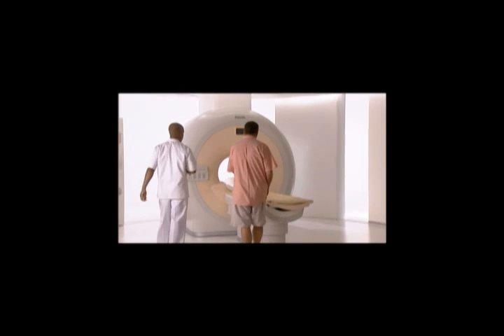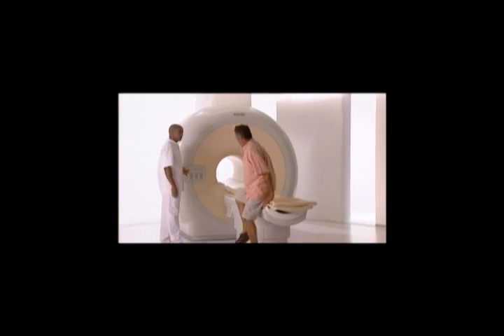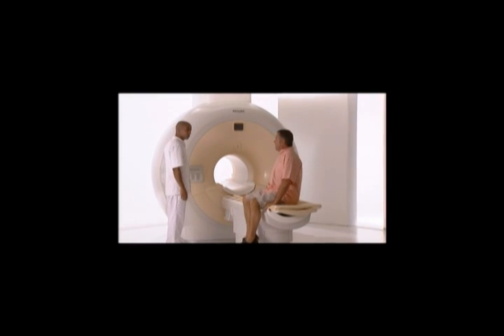The closer an RF coil is to the patient, the stronger the detected signal will be. For this reason, small RF receive coils can be positioned close to the region of interest for detailed studies. Some examples are head coils, knee-foot coils, and multipurpose flexible coils.